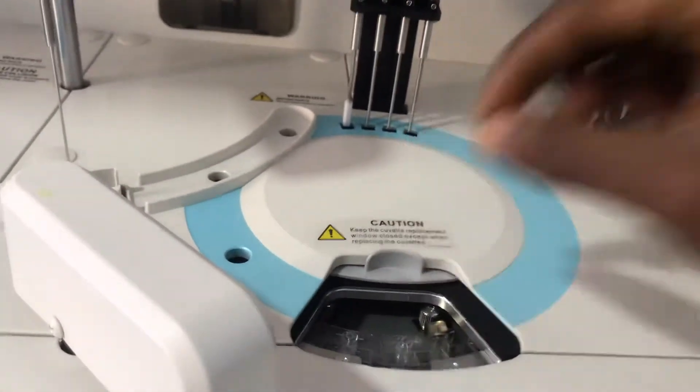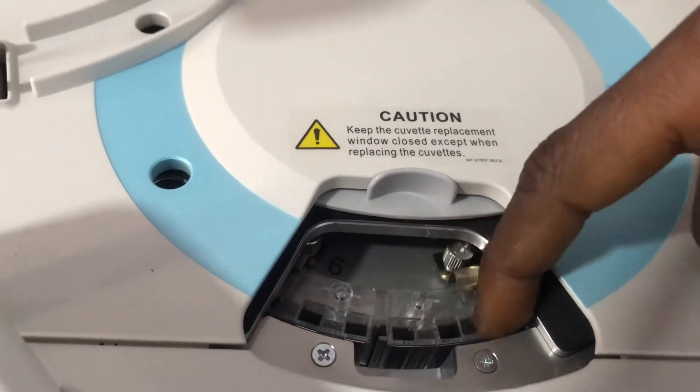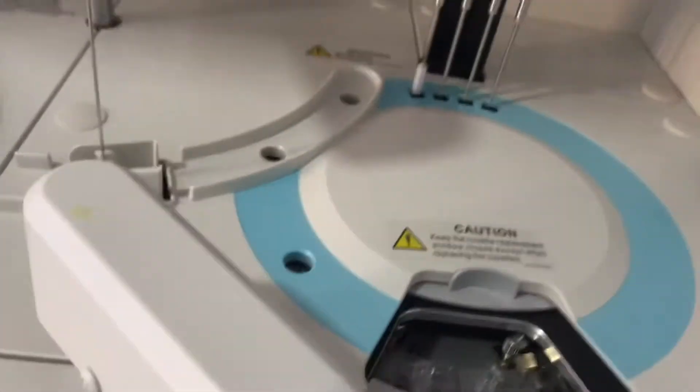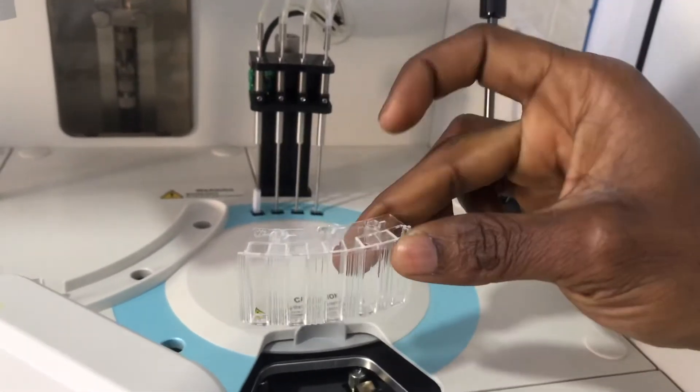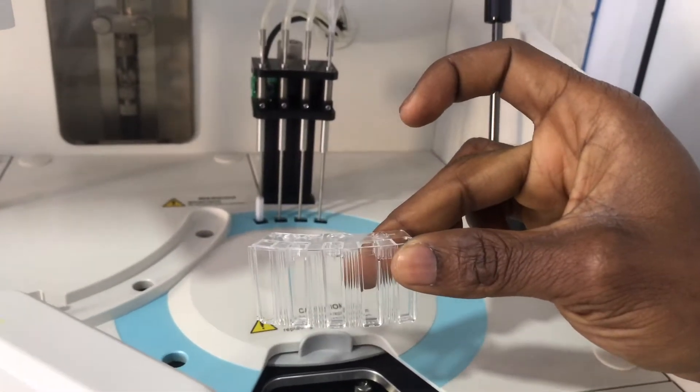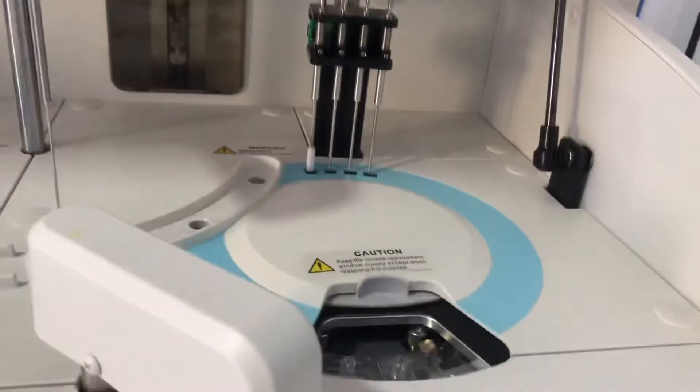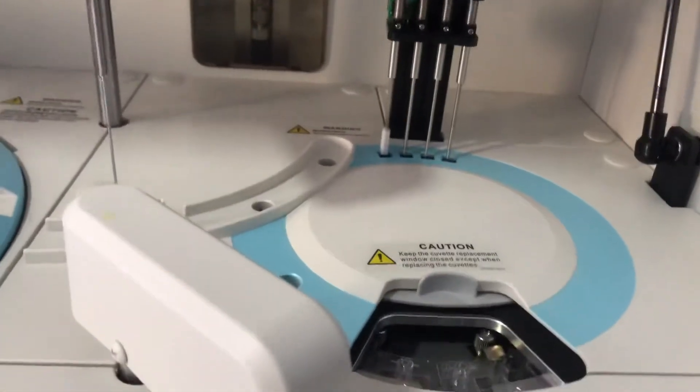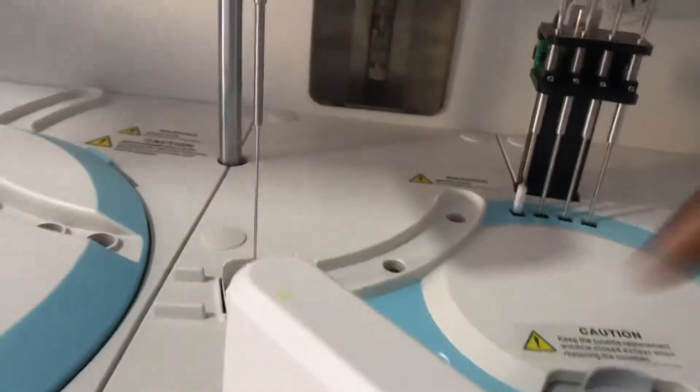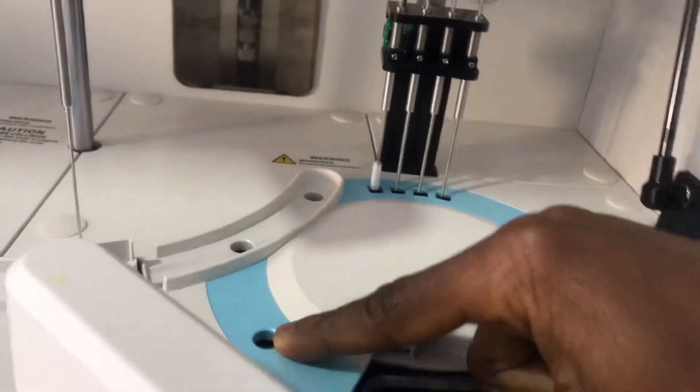Basically this is what we call the reaction carousel. In here we have cuvettes. These are cuvettes that we have here—they are in segments. Let me show you how it looks like. They are in there like that. You have five here and then there's eight of these in there. It's a turntable that moves around to wherever they are needed and then the reactions take place. Basically, this is where the mixing occurs. Anytime the cuvettes are moved to this position, you should know that there is mixing.